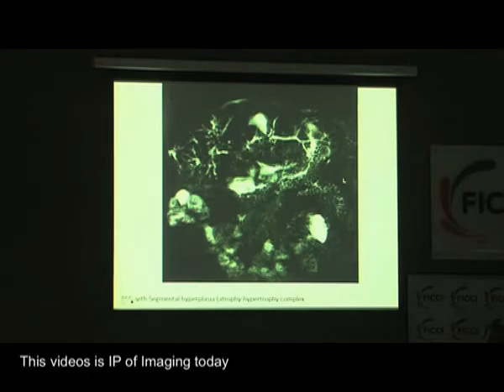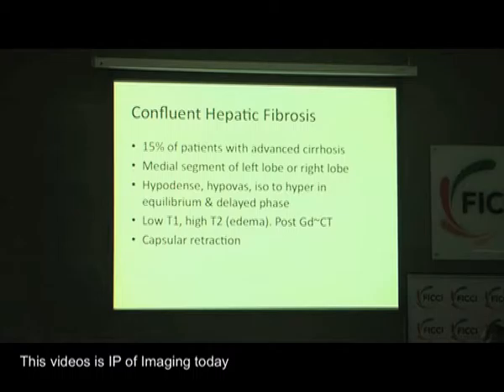So when you're doing MR of the liver, if you're a technologist and you find a liver pathology, or as a part of your standard protocol, it's not a bad idea to throw in these single shot T2 weighted MRCP images, because they will be incremental in adding to your diagnostic criteria.